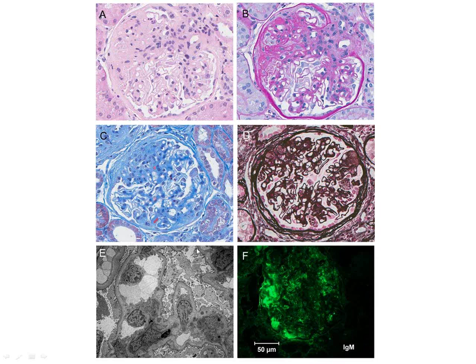Okay, so the question was, would we describe the parietal cells as being hypertrophied? And I think, at least on the silver stain, it's a little more cuboidal than we would like. So I think putting it in there is fine. It's not incorrect. I don't know if I gave it a point, but I'll look at how I graded the thing.